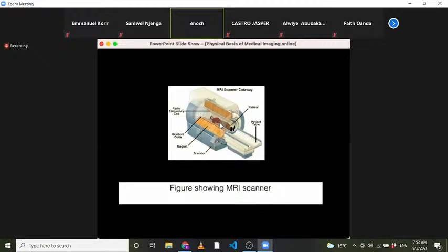Due to the influence of the gravitational pull, it will wobble. It is the same with the hydrogen nuclei or protons when they are placed in the external magnetic field. So we need to apply an RF field for resonance. Resonance is to have maximum absorption and emission of energy, so it is applied at the same precession frequency.